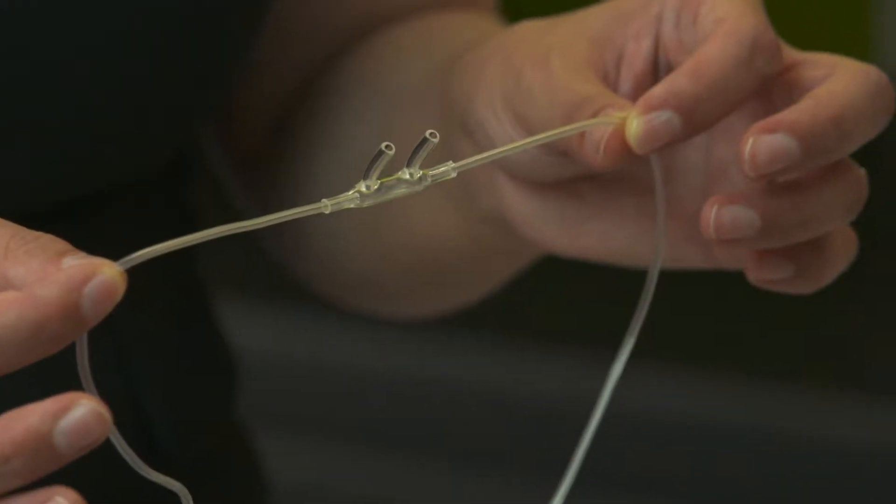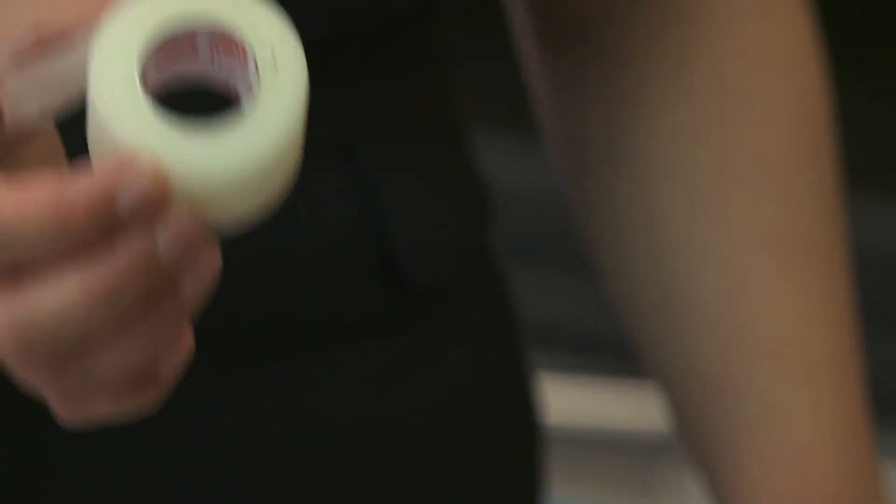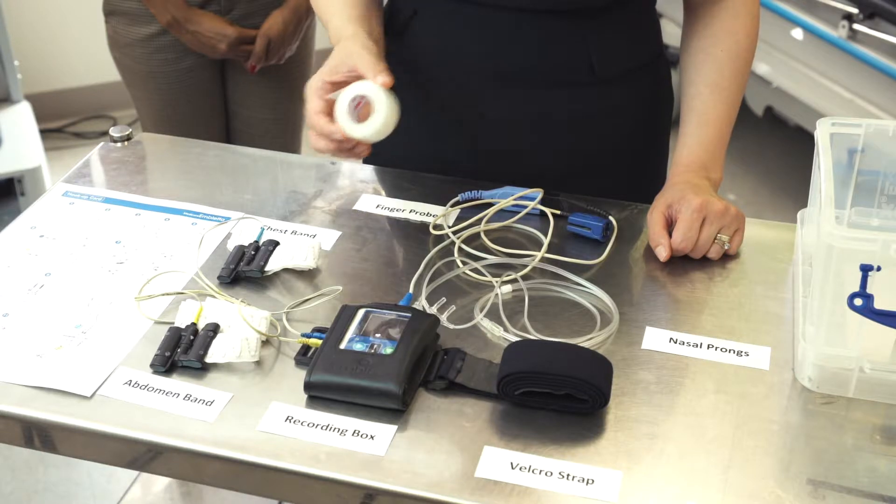The nasal prongs will go into your nostrils and with the tape we provide, so long as you're not allergic to it, you attach the tubing to both cheeks using the tape.